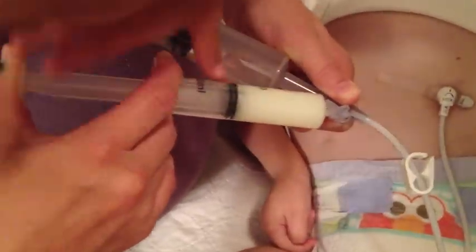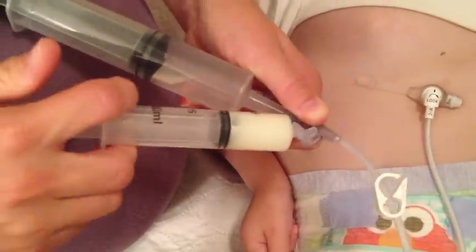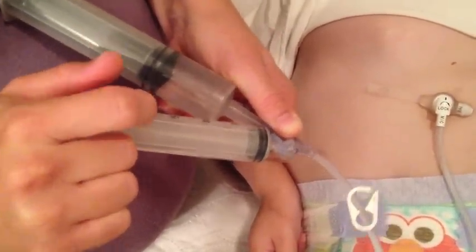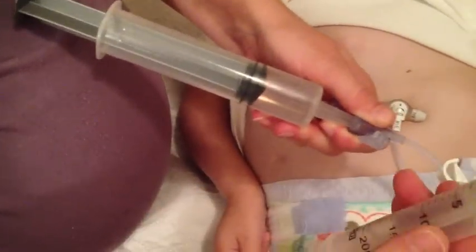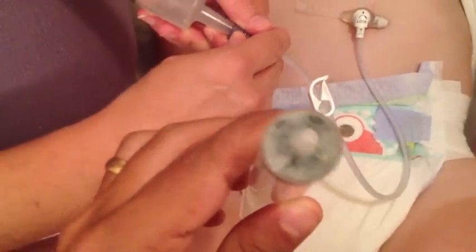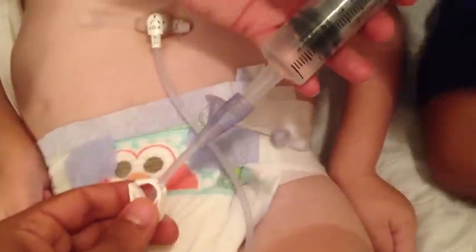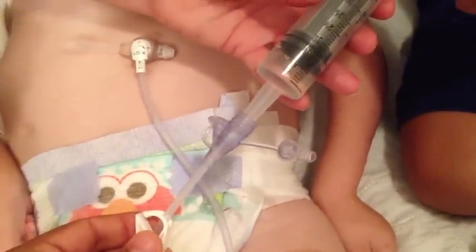The medicine, you want to go about twice as fast as the water. Push them through to get his meds in. Make sure all of his meds are gone — if you see any meds still in the tube, suck some water back in by pulling the plunger, mix it up and shake it, then push it back out. Once that's done, take the small syringe out, close the small port, then open it back up and push water through to flush the rest of the meds out of the tube.